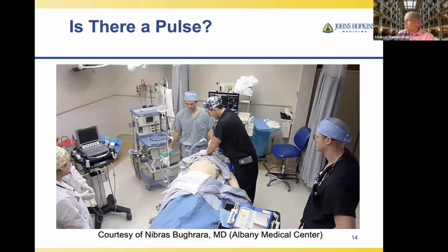And many studies were done in the cardiac operating rooms, when they asked people to detect a pulse when there was clear cardiac activity, blinded to the readings on both ultrasound, transesophageal echo, and arterial line tracings. And it does take over 20 seconds to determine that.